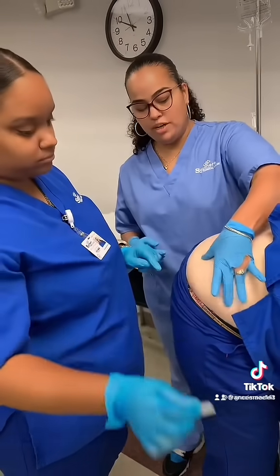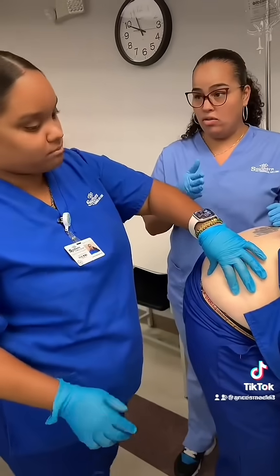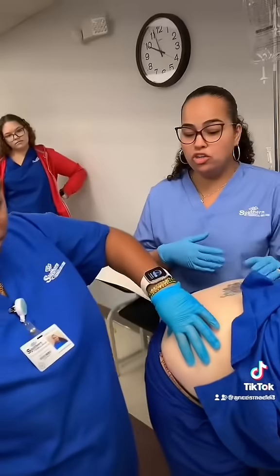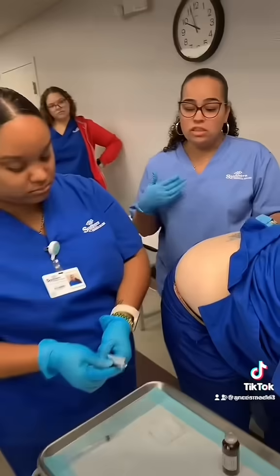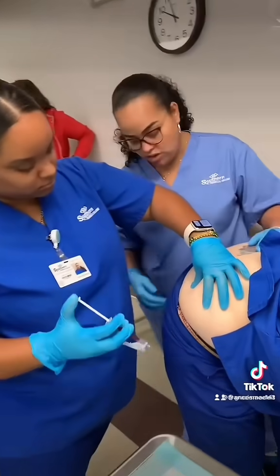The best thing to do is to grip the muscle. We're going at a 90-degree angle, so the entire one-inch needle has got to go into the muscle. Anytime you do an intramuscular injection, the BMI of the patient determines how you go.